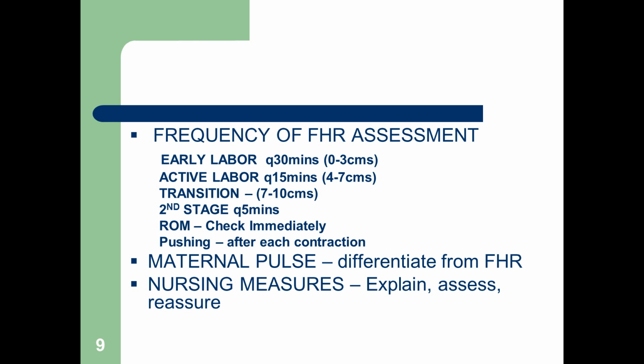Frequency of fetal heart assessments. Well, certainly you're going to use a Doppler or a fetal heart, the little dop tone. You're going to count for 30 seconds and double. Now, if you're having a hard time counting it, or if the heart tone is a little unusual, maybe skips a bit, you want to listen for a full minute, okay?